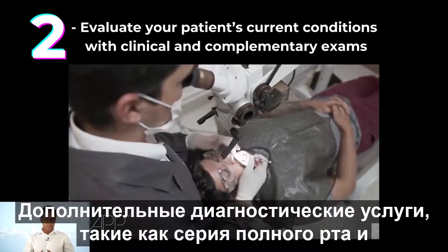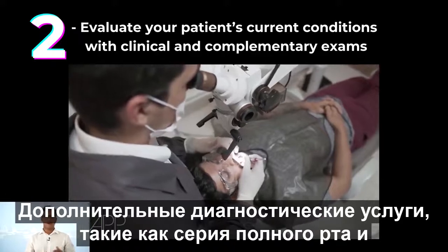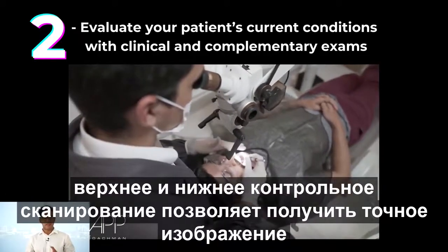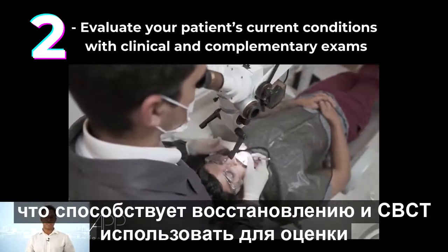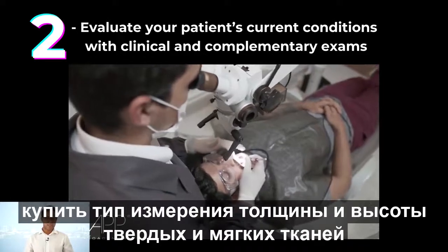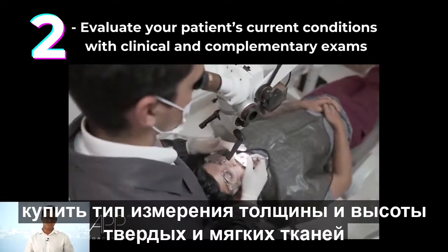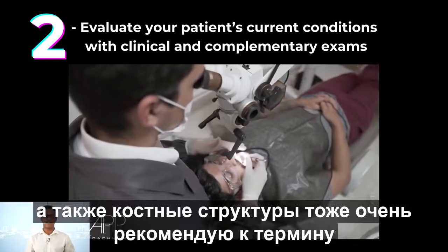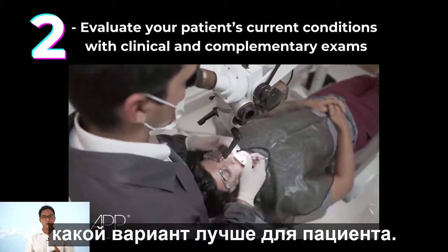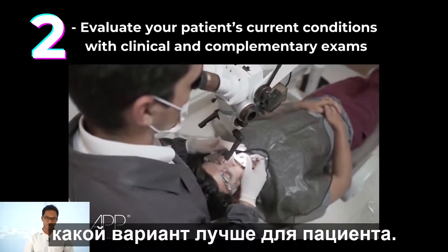Complementary diagnostic services such as a full mouth series and upper and lower intraoral scans allow you to produce an accurate image that contributes to the restorations. And a CBCT, utilized for evaluation of biotype, measuring hard and soft tissues, thickness and height, as well as bone structures, is also highly recommended to determine what the best treatment option is for your patient.